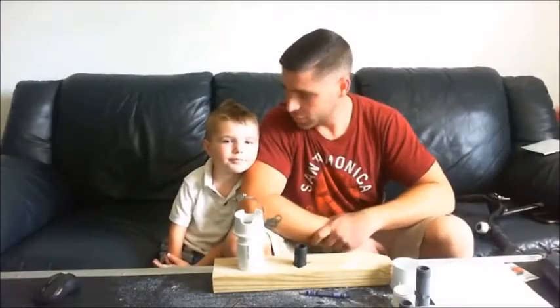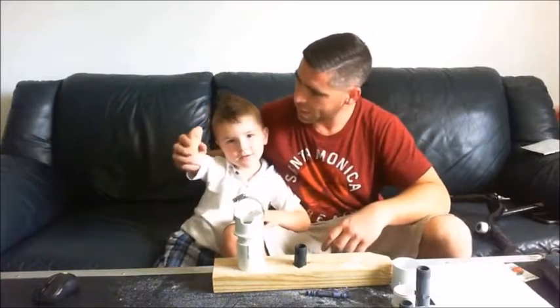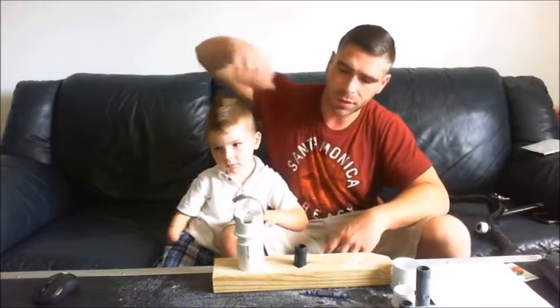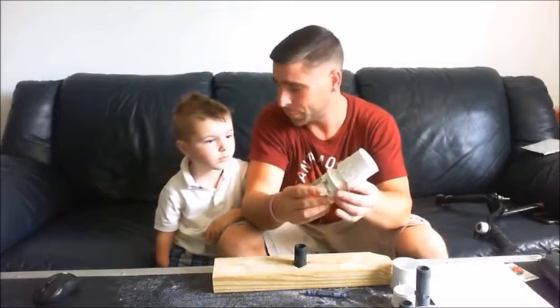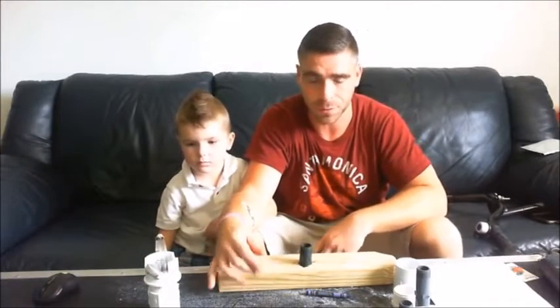Hi guys, I'm Mike and this is Carter. Say hi Carter. Hi. Carter was born without his right hand and we had some problems when it came to riding a bike. What we did is we built an adapter that attaches to the handlebar that makes it easier for him to reach it on the right side. I'm going to show you how we did that and what parts we used.